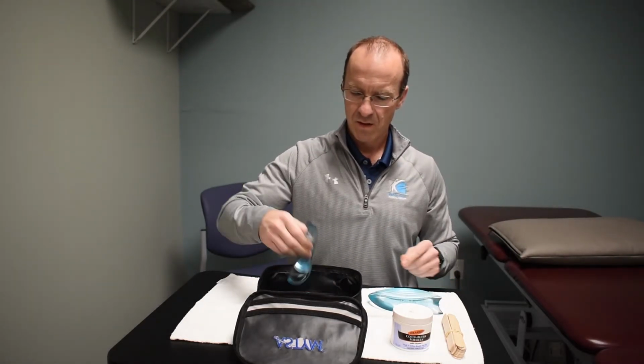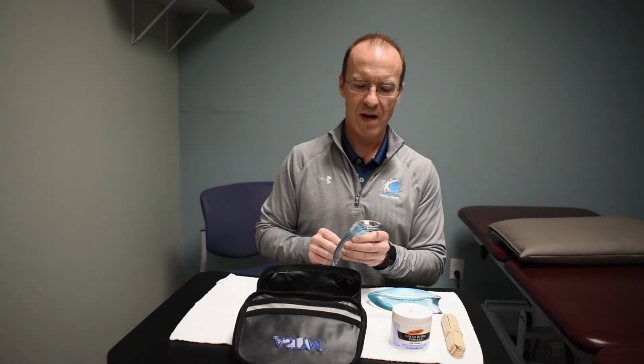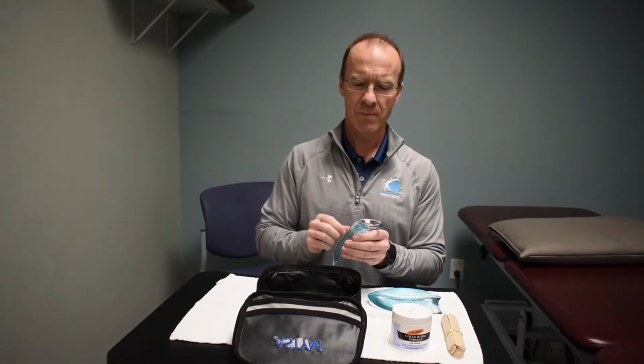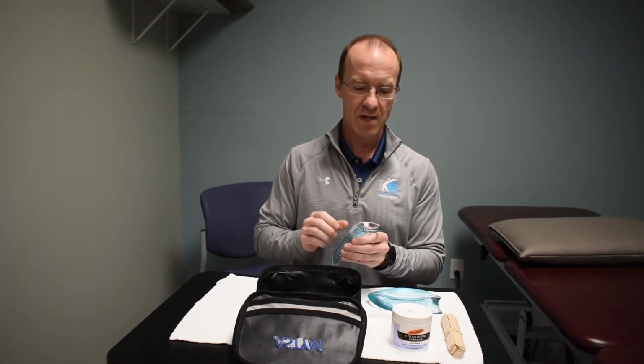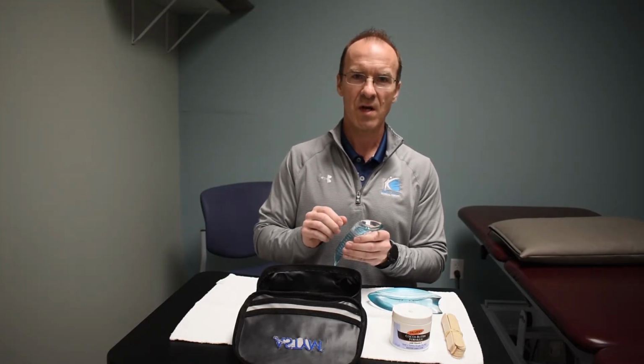Okay. The next tool that we're looking at is called the Localizer. And the Localizer, as you can see, has a more beveled edge. It's a little bit more rounded and it's not quite as broad. So because it has less surface area to it, it's going to penetrate a little bit deeper into the tissue. This is where we're going to really start to affect some change onto the tendon itself.